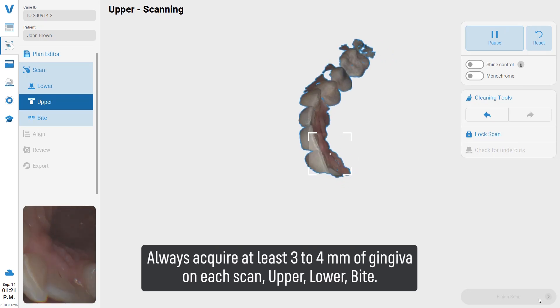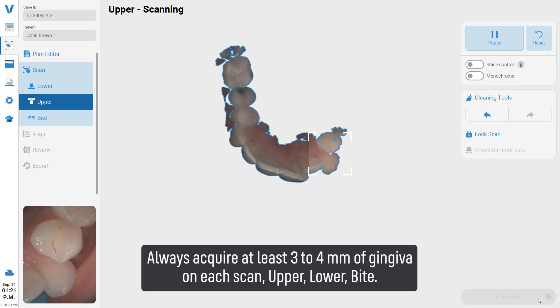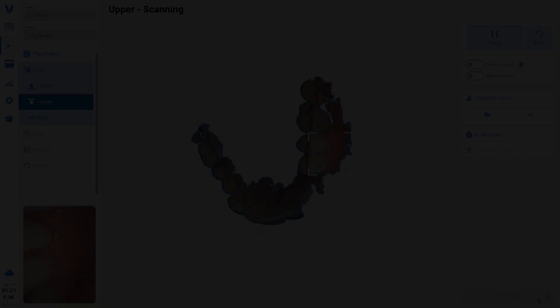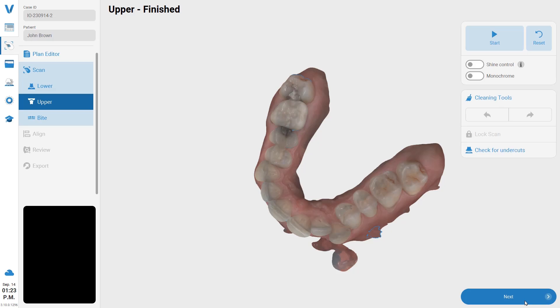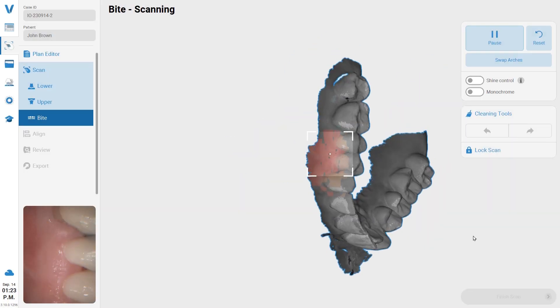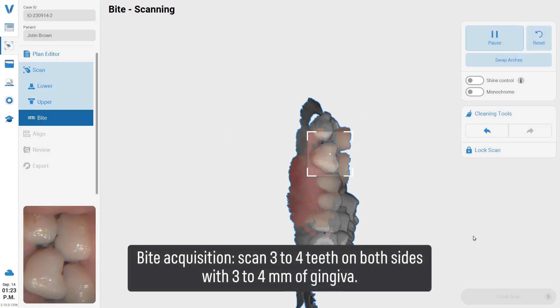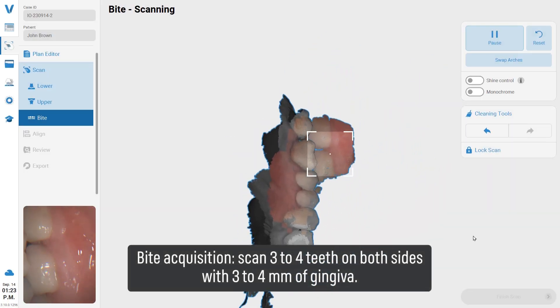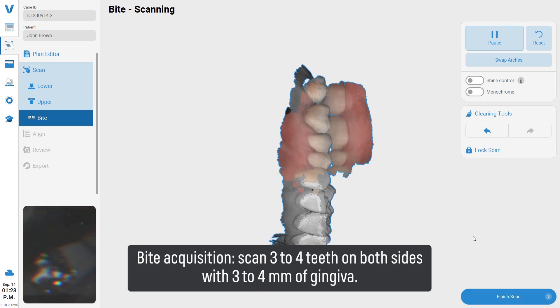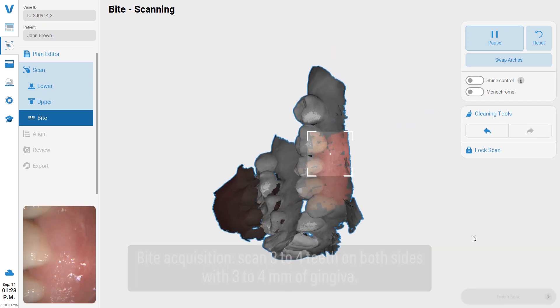For upper, lower, and bite scans: during bite acquisition, scan three to four teeth on both sides with three to four millimeters of gingiva.